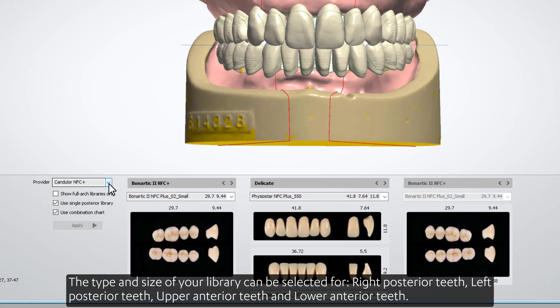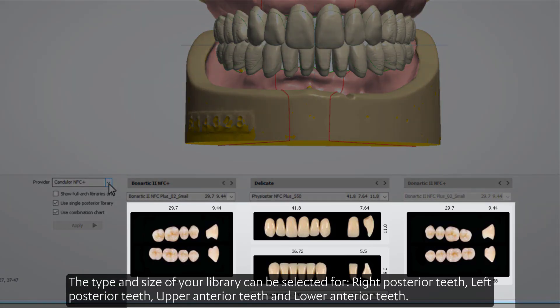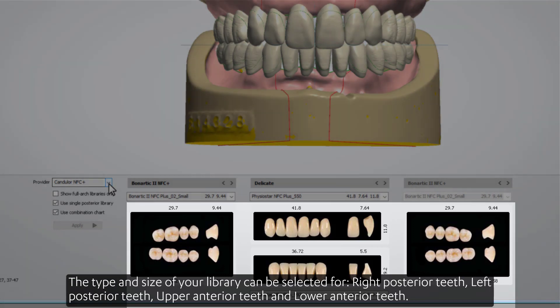The type and size of your library can be selected for Right Posterior Teeth, Left Posterior Teeth, Upper Anterior Teeth, and Lower Anterior Teeth.